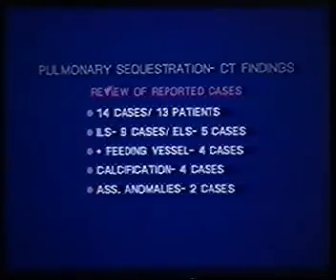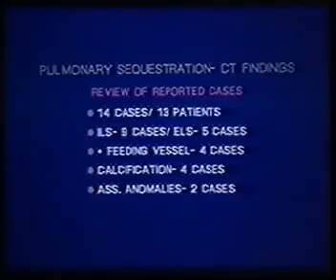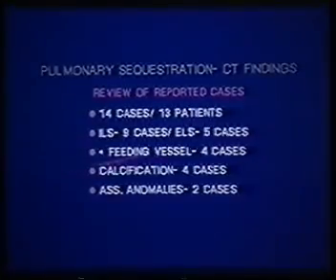I looked at the literature and kind of reviewed what had been reported previously, 14 cases. There have been more subsequent to the time I put this together. Not insignificantly, the diagnosis, which usually rests on the ability to see the feeding vessel, was actually only reported as being visualized in a minority of cases. And that was a lot of the logic of why I thought it was important to start using MR for this particular subset of patients.